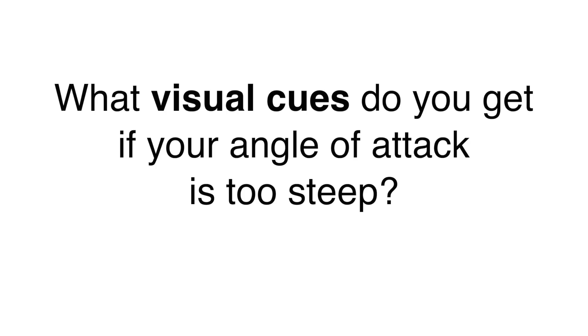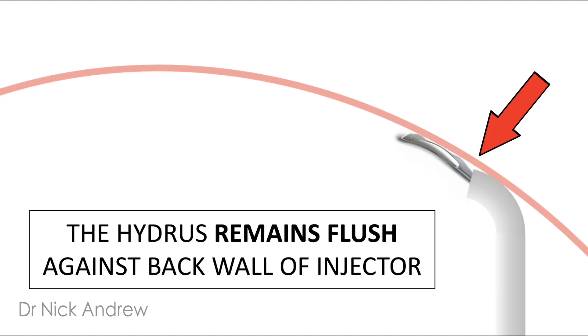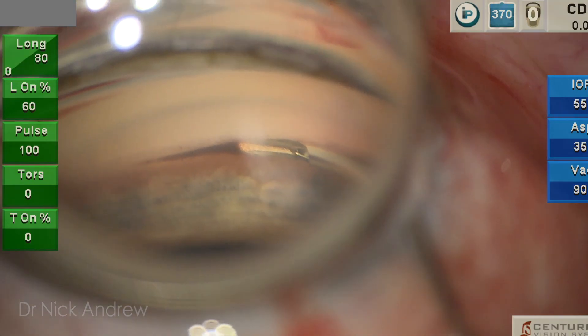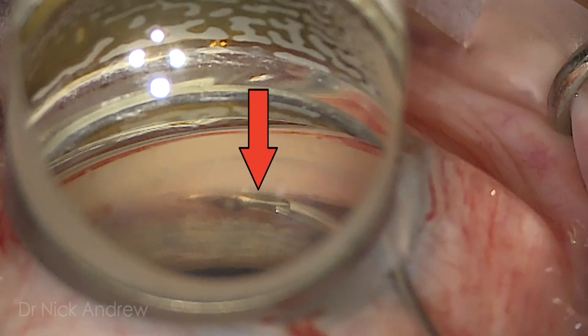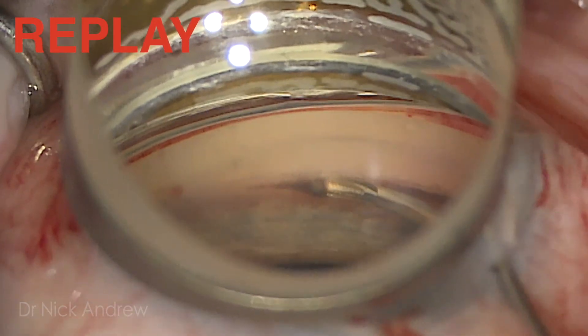There's an important visual cue if your angle of attack is too steep. With a nice flat angle of attack, as the first window of the hydrus is advanced, you'll see the hydrus remains flush against the back wall of the injector. In contrast, if you have a steep angle of attack, the hydrus will strike the outer wall of Schlemm's canal and be pushed away from the back wall of the injector, forming a gap. Here's an example of a steep angle of attack — as the first window advances, it strikes the back wall of Schlemm's canal and a gap forms between the hydrus and the back wall of the injector. If you see this gap form, stop and relax your hand.